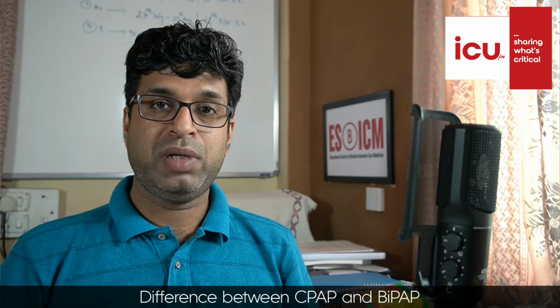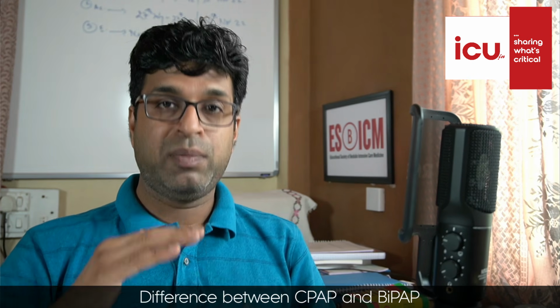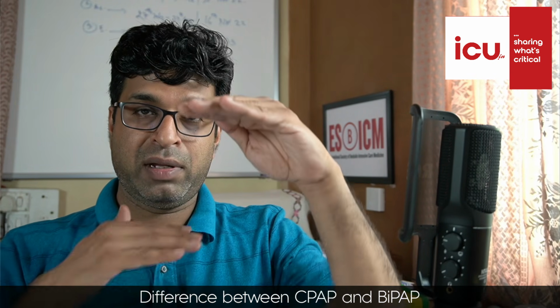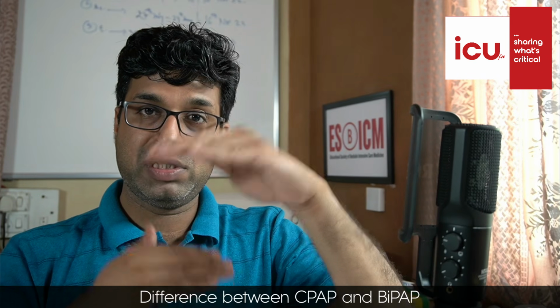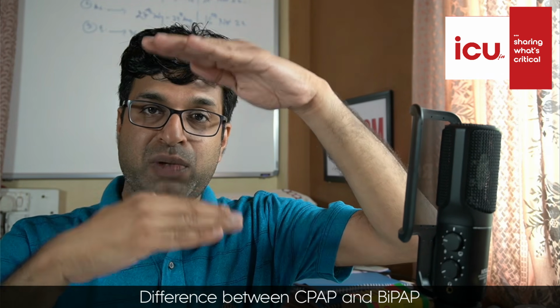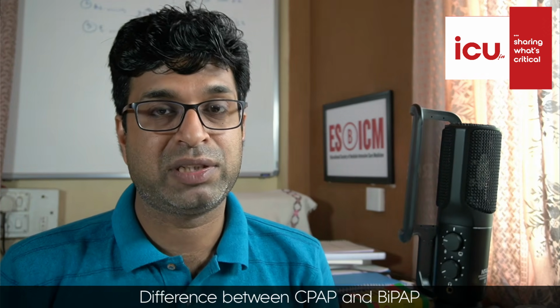Meaning for PCO2 to wash out, there should be movement of the chest. So IPAP should be high and EPAP should be low. If your IPAP is 15 and EPAP is 5, the difference between the two is 10. So that is a fair enough difference. But if IPAP remains 15 and your EPAP is 10, then the window for the chest to expand and collapse is low. So it can happen that your PCO2 rises in this patient.